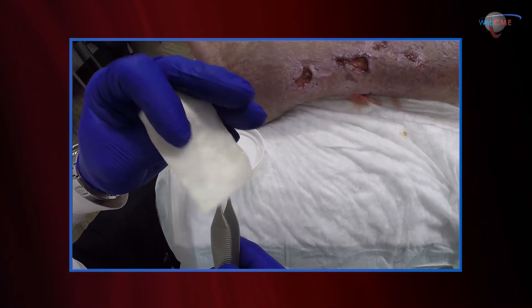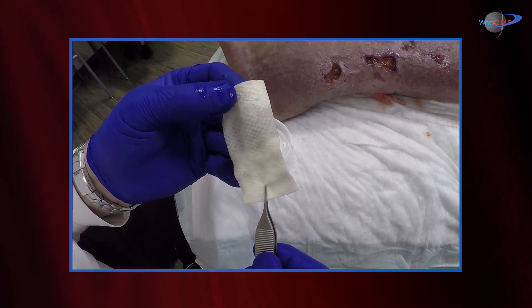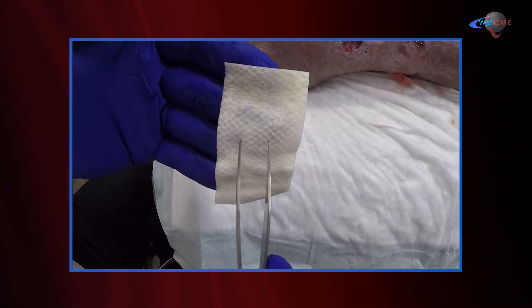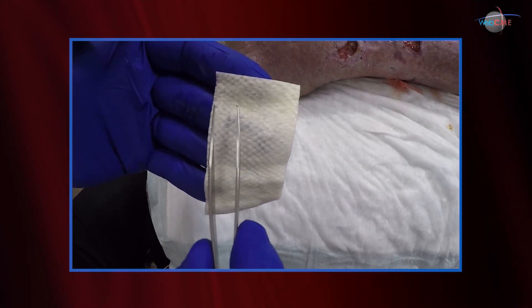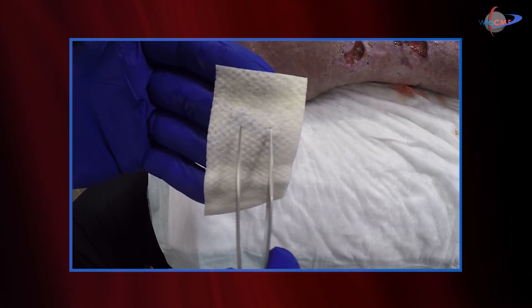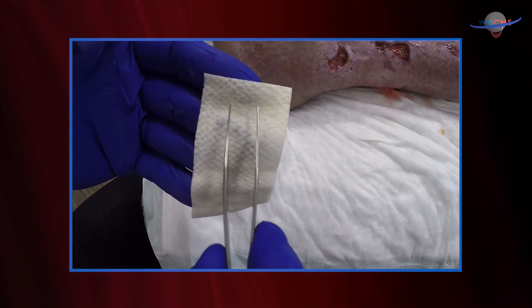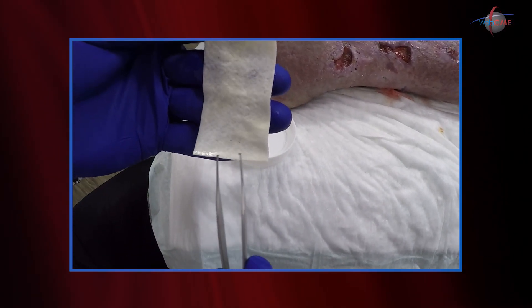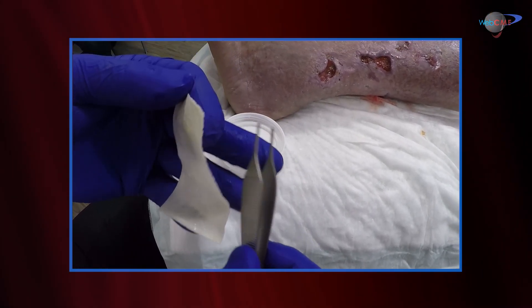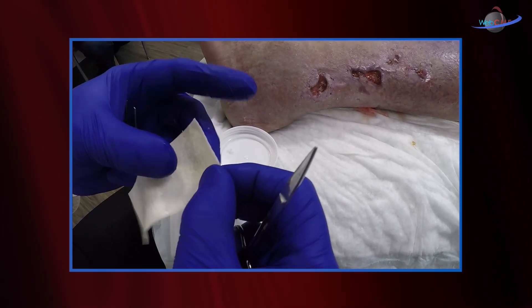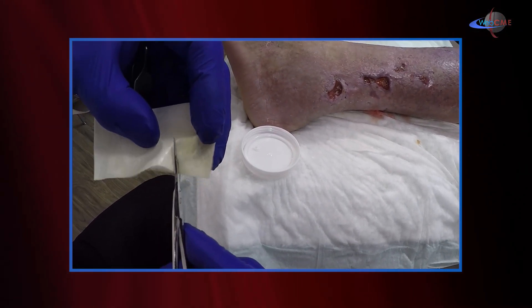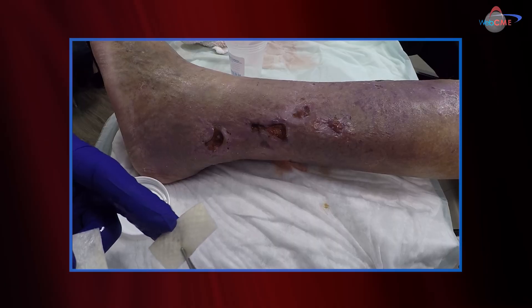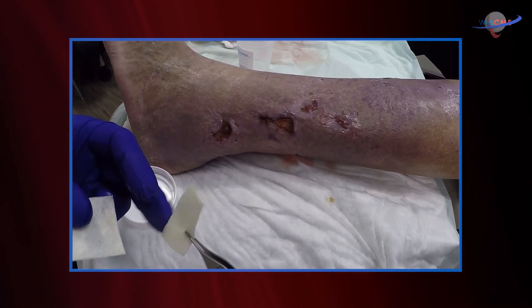Now there are two sides to this graft. As I mentioned, it's processed from Icelandic Cod. This is the externalized surface — this is where the graft met the outside world, the ocean. This has been stripped of all surface issues — scales, skin, etc. This is the underside, the basement membrane type of surface. We're going to go ahead and harvest enough of this to apply to the wound base. We apply the dermal matrix down to the wound base, with the externalized surface staying outside.